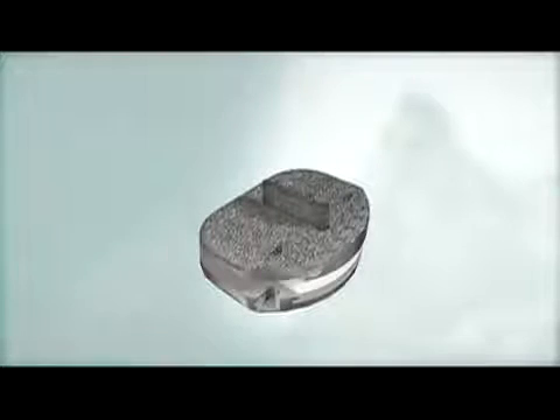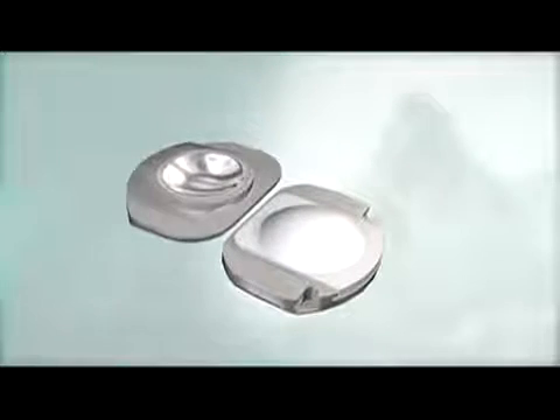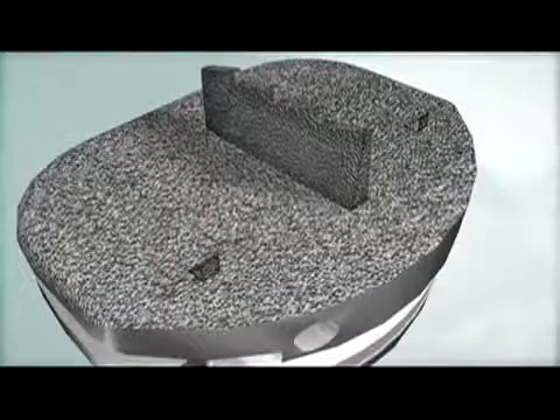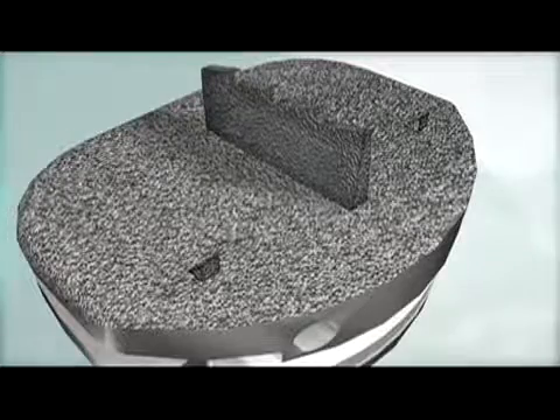The ProDisc-L implant is based on a ball and socket design. ProDisc-L end plates have patented central keels and lateral spikes for initial fixation to the vertebral bodies, and a plasma sprayed titanium coating on all bone contacting surfaces to promote bony integration.